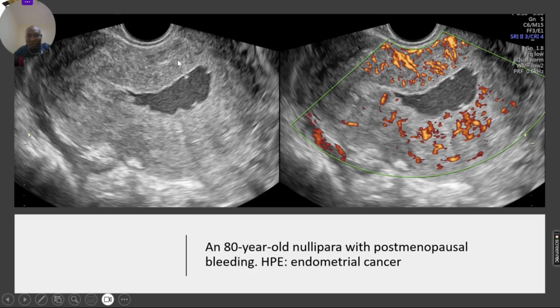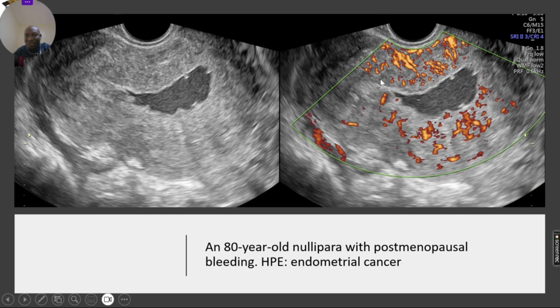Here was an 80-year-old. Look at the size of the uterus in this nulliparous woman who presented with post-menopausal bleeding. Because of blood within the endometrial cavity, you can see multiple tiny polyps. I thought one was a blood clot, but on application of color Doppler you can see it is live tissue. Natural enhancement on the 2D image shows looping dilatation and stenosis, all features suggestive of malignancy.